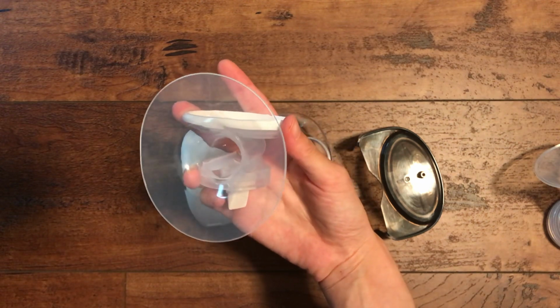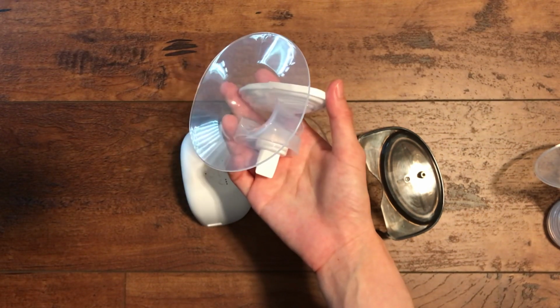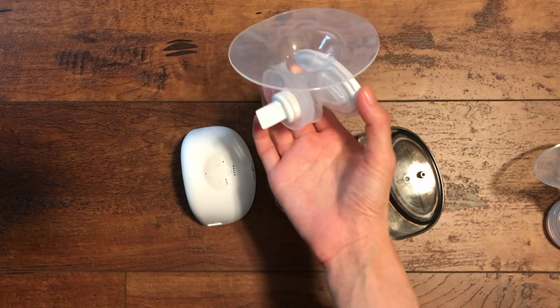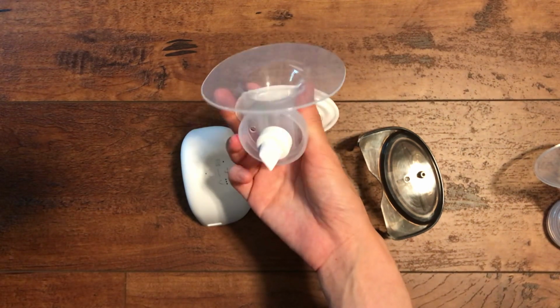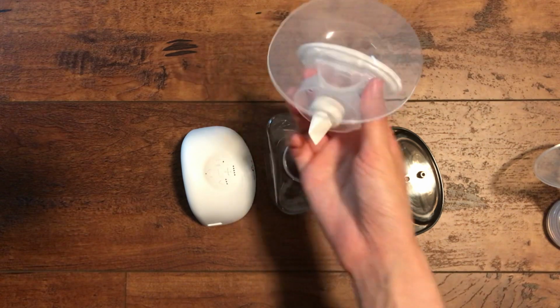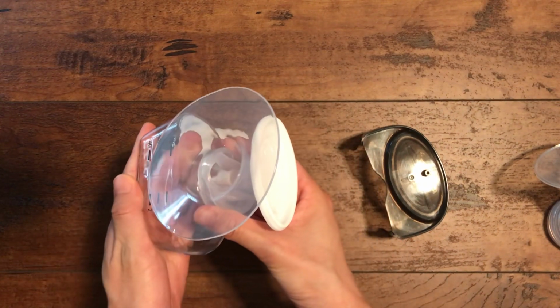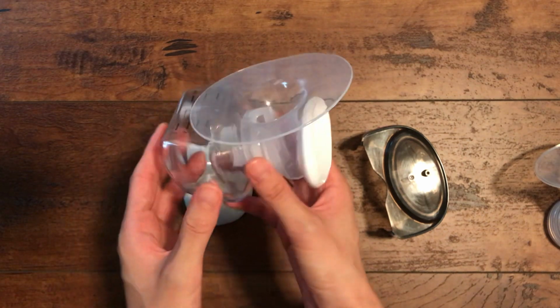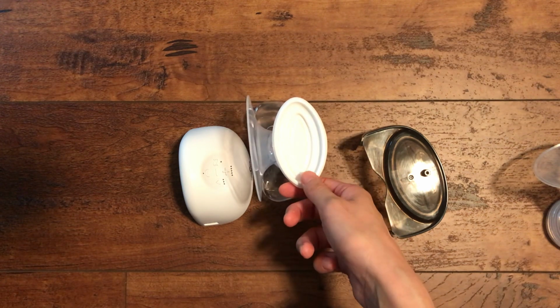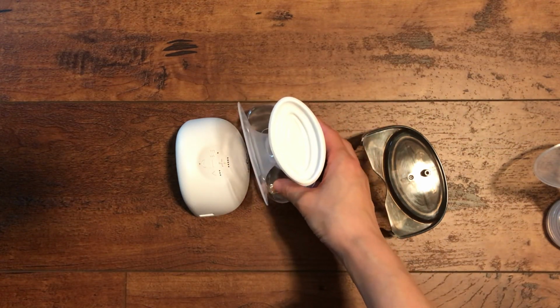And for some other people who have a smaller size, you could try to purchase a cushion or an insert to put in here. I haven't tried it yet, but if it keeps having issues, that was going to be my next step. I was considering purchasing an insert if I couldn't get it to work, but I think I kind of have it down. I need it to work 100% of the time for me, because when I go back to work, I can't waste my time trying to pump and it doesn't work. So I'll play around, and if I have any failures, I'll try to buy an insert and see if it works. Otherwise, so far so good for me.